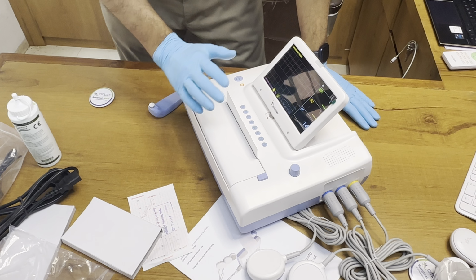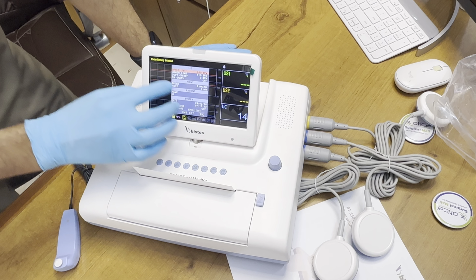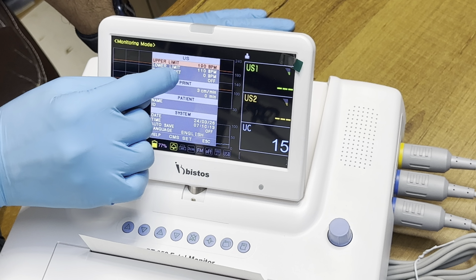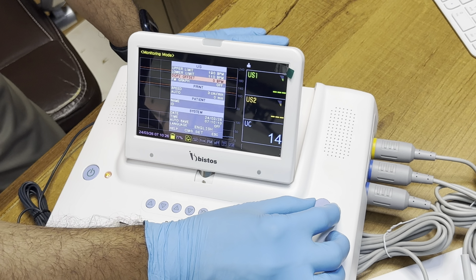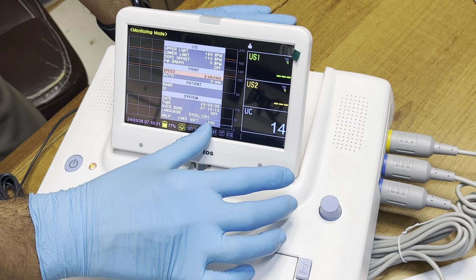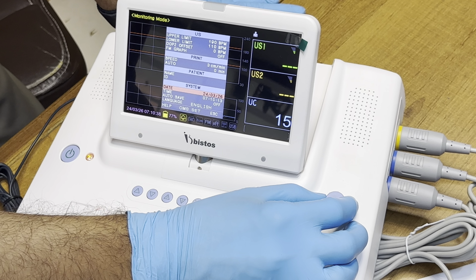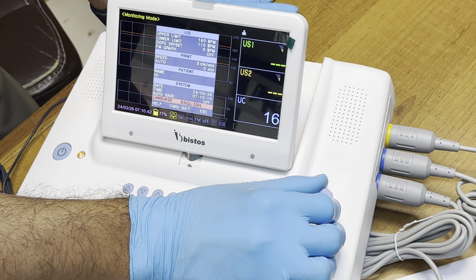Okay, so now there are functions. This function is a menu button. You can set the alarm. This is the upper limit of the beats per minute. Then this is the lower limit. This is the DOP2 offset. This is the FM graph. This is the print speed, 3 cm per minute. You can adjust the things accordingly. You can set the name of the patient from here. You need to put the ID. Then this is the system. You can adjust the time and everything from it. We are just escaping it.